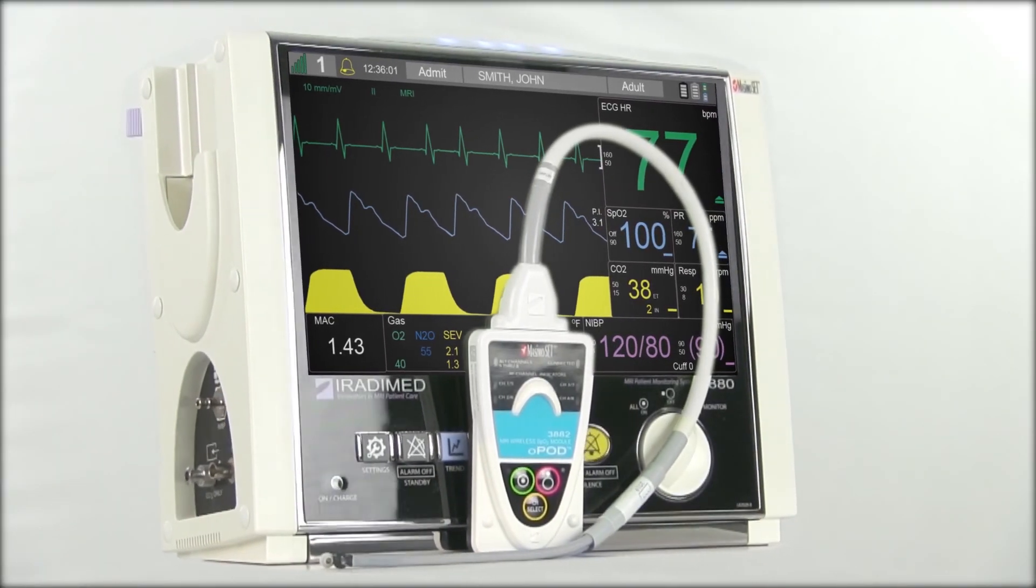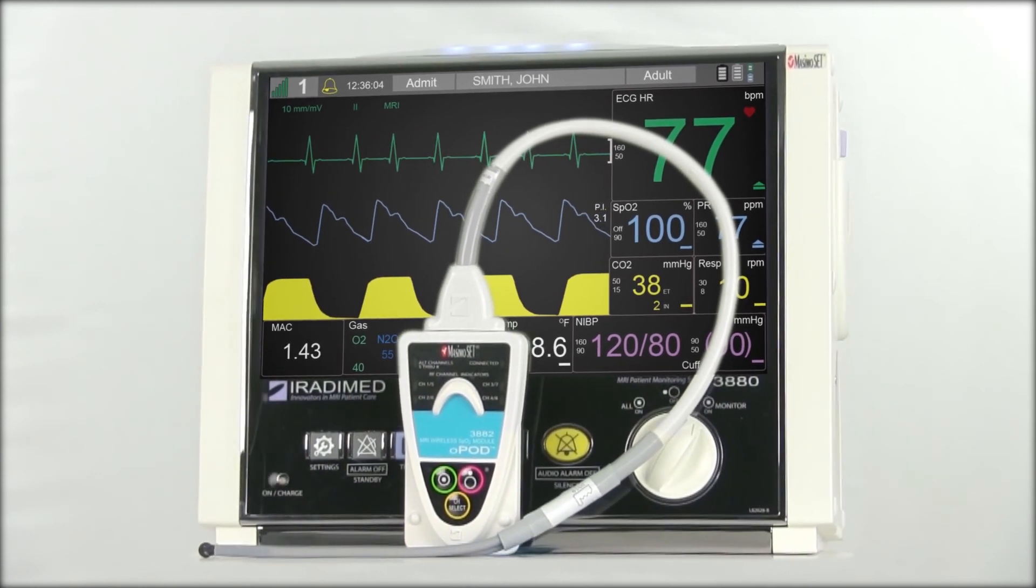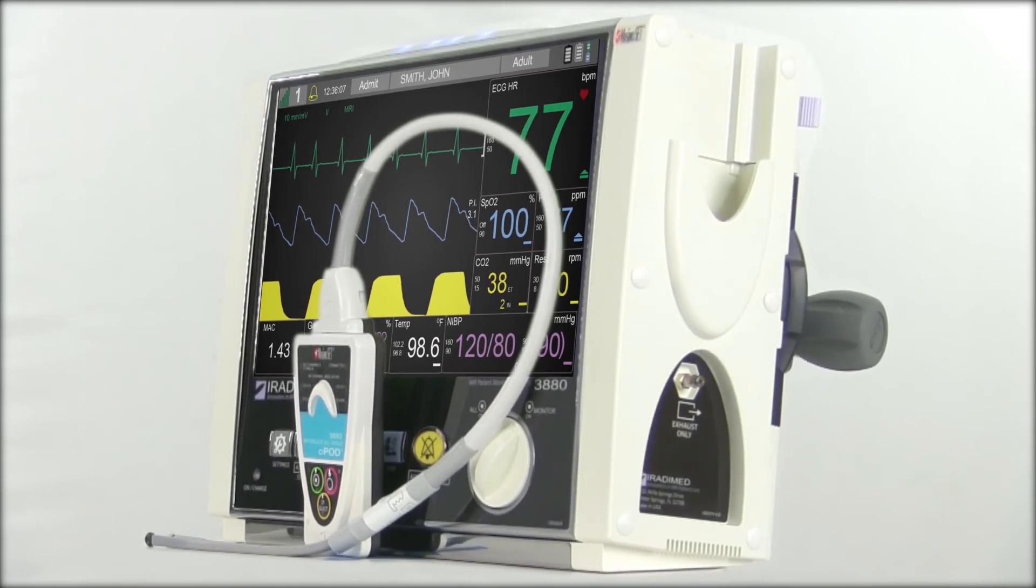In this video, we are going to review the essential steps of preparation and application of the SpO2 OPOD and the pulse oximeter attachments for the 3880 MRI patient monitor system.